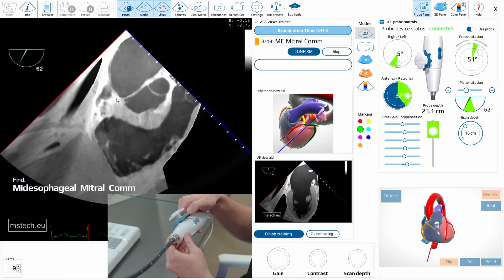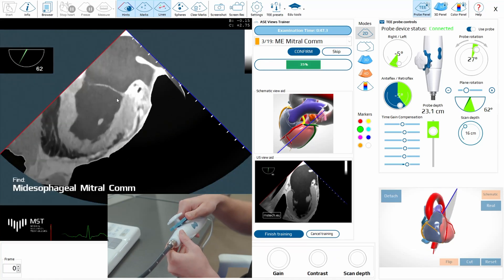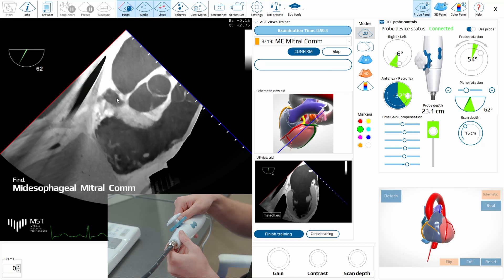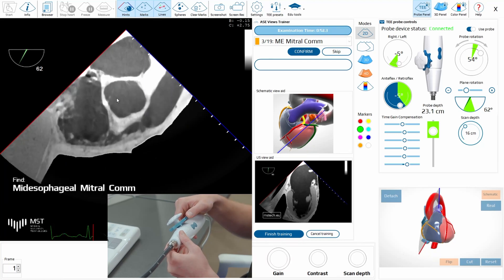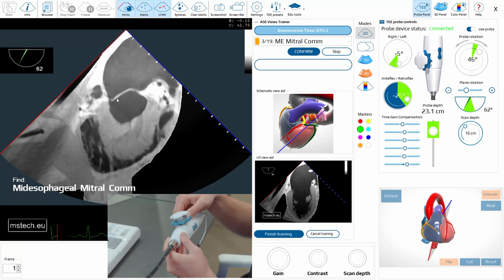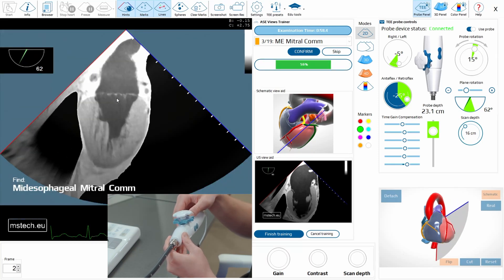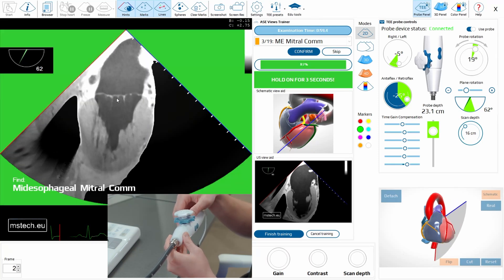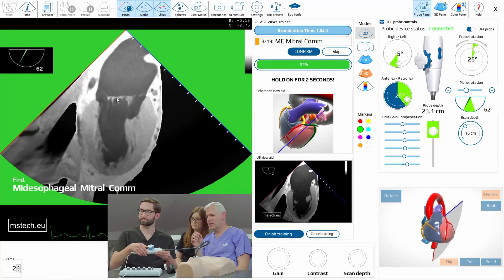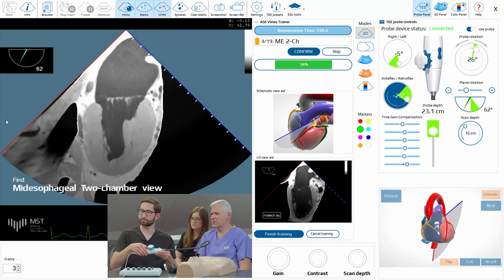Slight rotation to see the valve and the ventricle. Go slowly. It was there, but slightly, because you should see the coaptation line rather than the posterior part of the annulus.